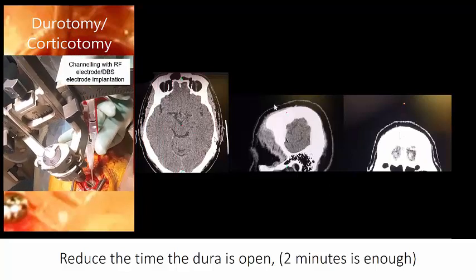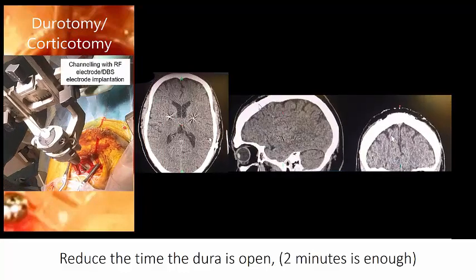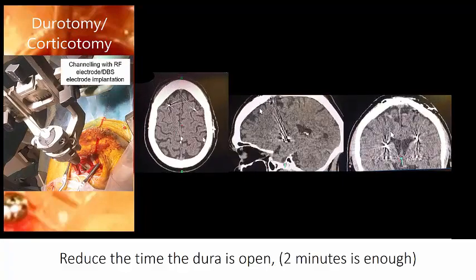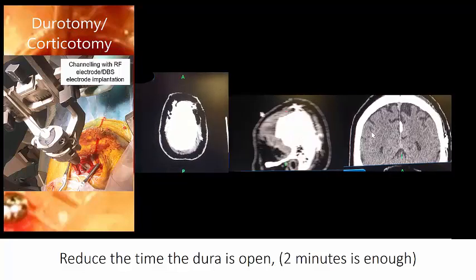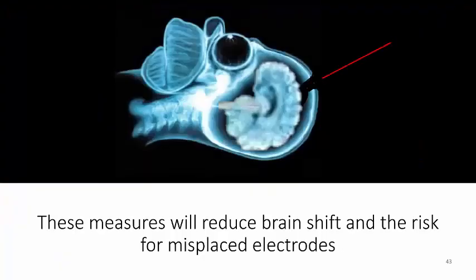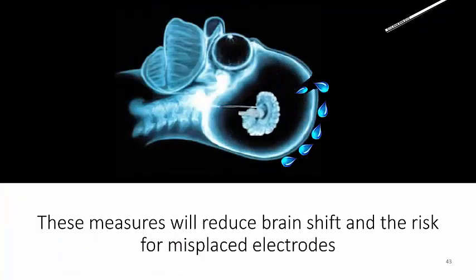When this is in place, I seal the burr hole using tissue glue. Typically, by using this technique, we will not see any air or brain shift after the procedure. These measures are taken together to reduce brain shift, and hence the risk for misplaced electrodes.